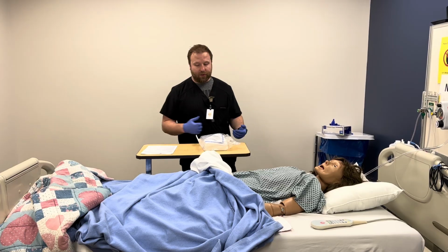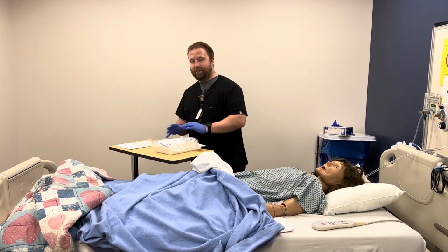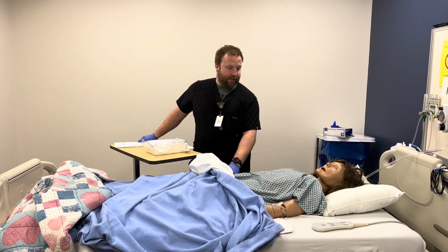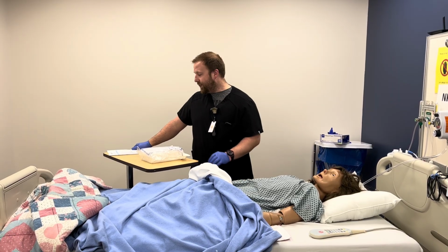I'm going to knock, introduce myself. I'm going to provide privacy, hand hygiene, and I've gathered my equipment here. I wanted two identifiers, can I have your name and date of birth, and check at 6842, and I've verified this on my bracelet.